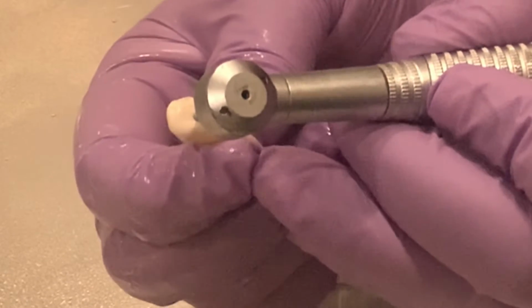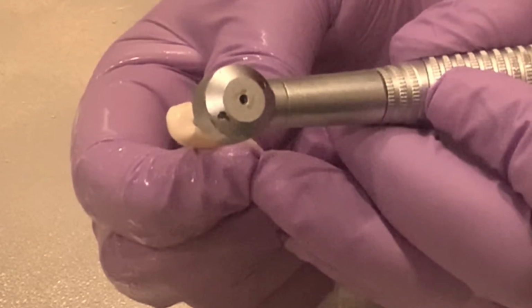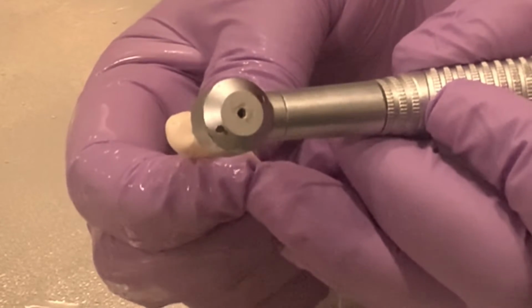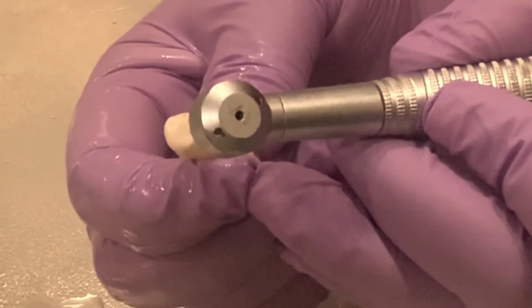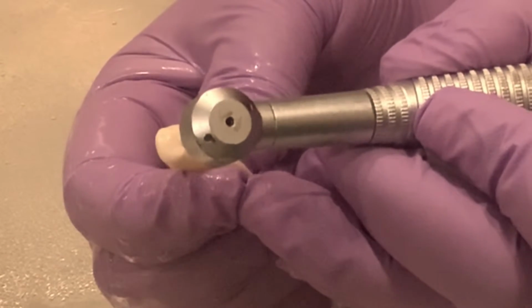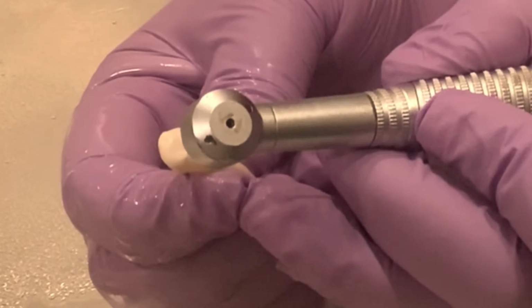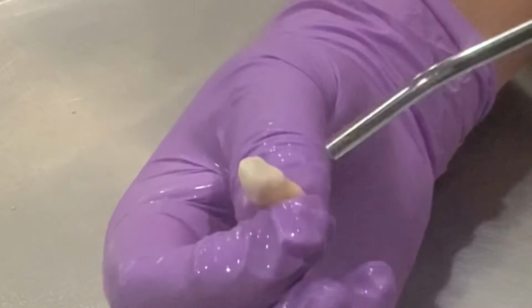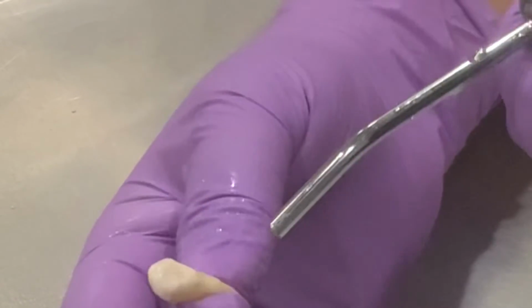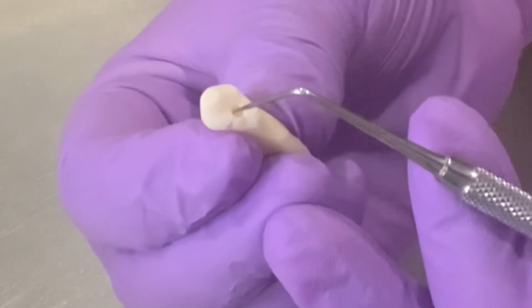The pulp chamber of the canine is the largest of any single-rooted tooth. In the cross section, it is ovoid in shape. It has only one pulp horn, which corresponds to its one cusp. We have made a notch by cutting through the enamel.